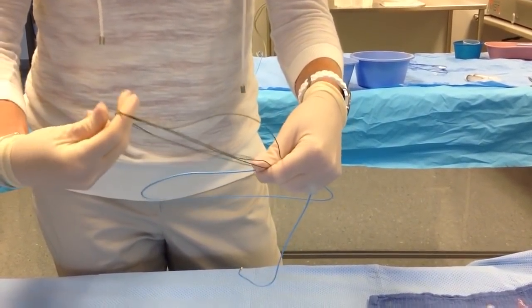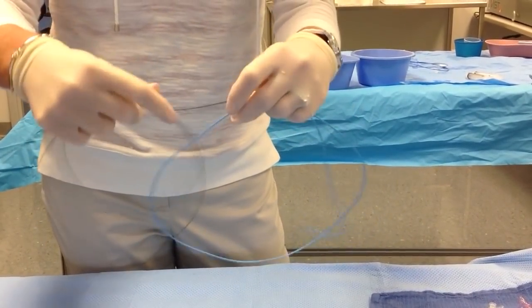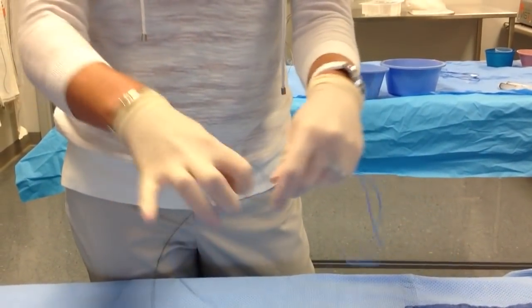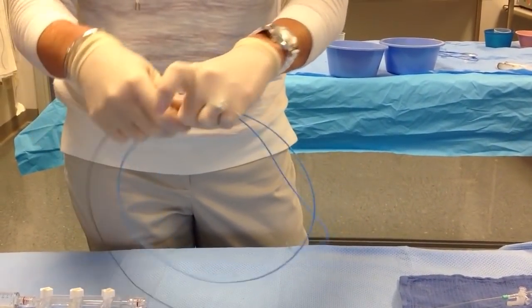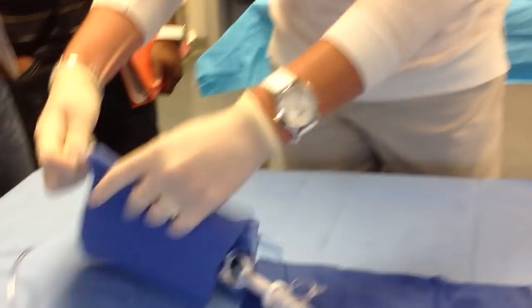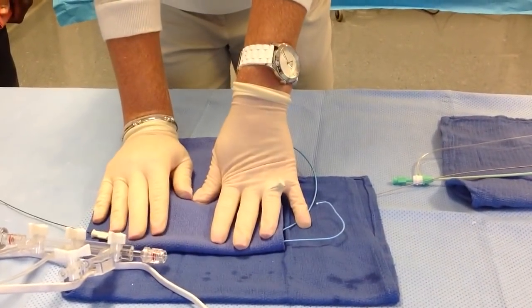So all of this is done before the physician's in there, the cardiologist? Yeah. Hopefully. Sometimes they come in. Unless it's a call in the night or something. Sometimes they come in when you're not ready, but it really doesn't take long to do this setup. I mean, it seems like it would, but it really doesn't. So if they do come in while you're doing it, I just keep it under there like that, okay?